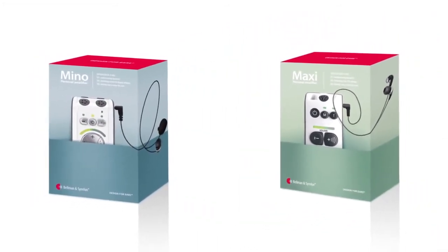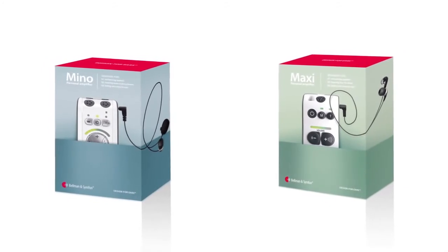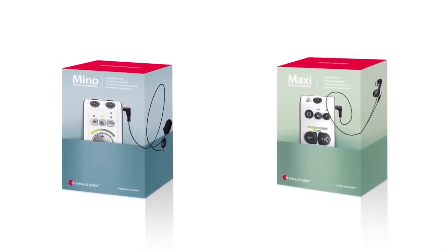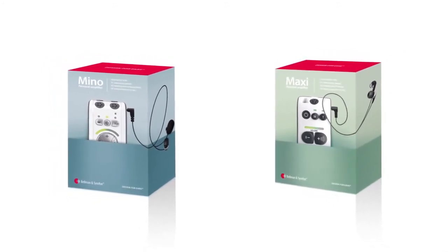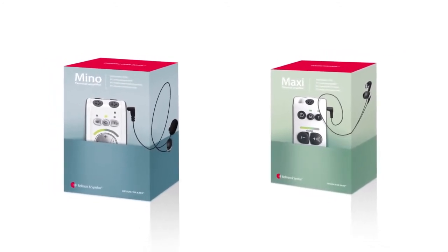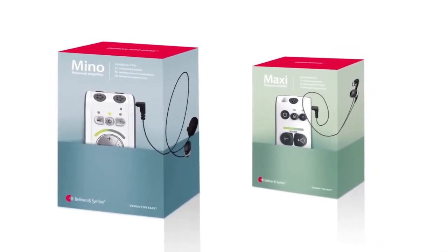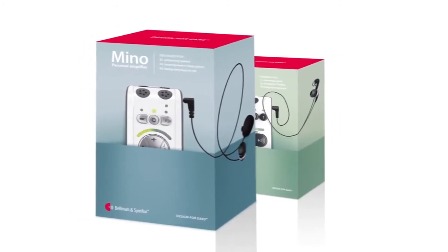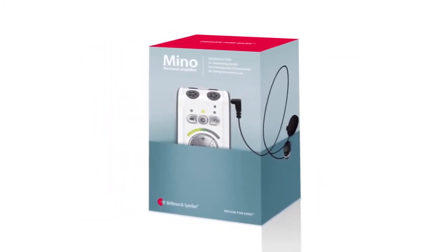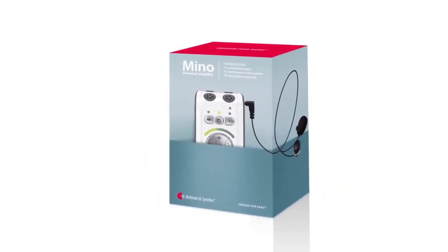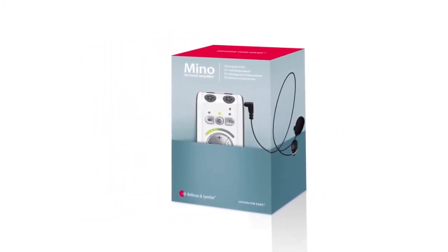Mino is our most discreet and flexible model. It is pocket-sized, equipped with a directional microphone, and offers many opportunities for customization.